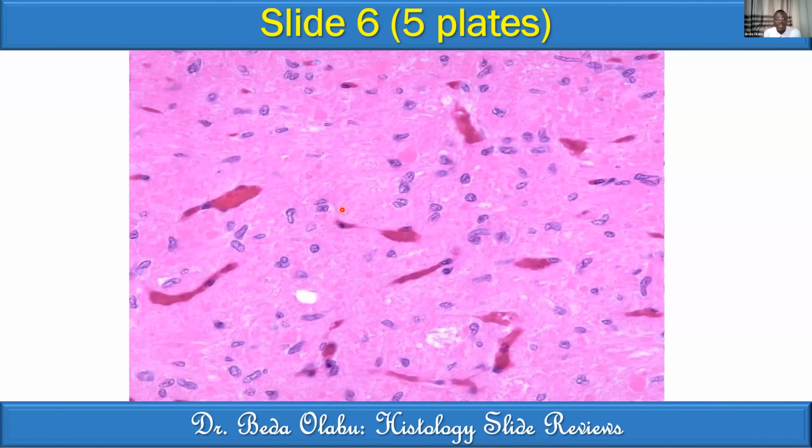So these are cell bodies of the supporting cells. We call them pituicytes. So that's the second thing I want to pick, that you can see pituicytes, the nuclei of pituicytes, which are the supporting cells. The third thing I want to pick are these things which look like that, or like that, or like that. So they look ovoid, homogeneous. These ones are called Herring bodies.